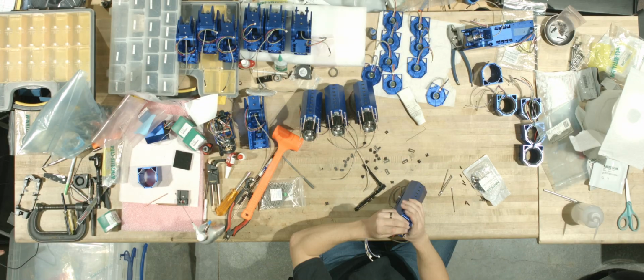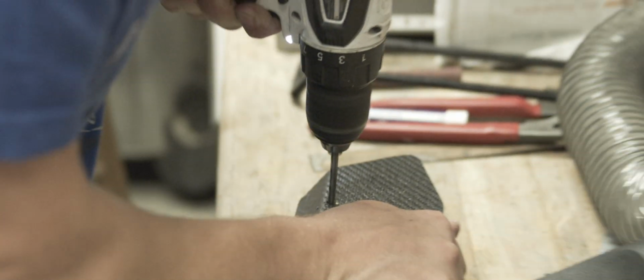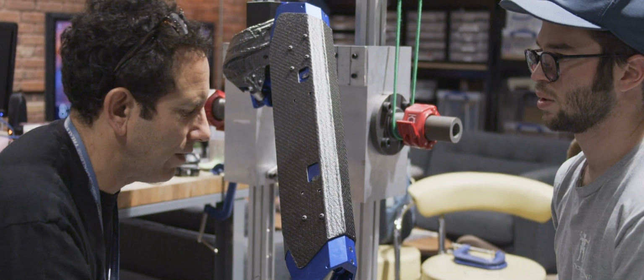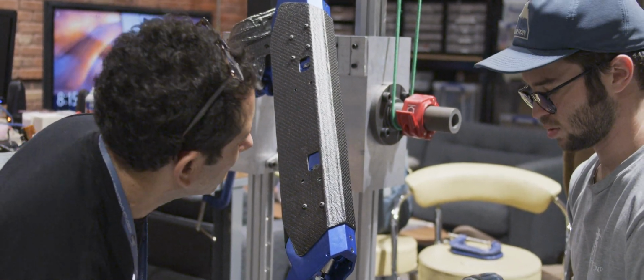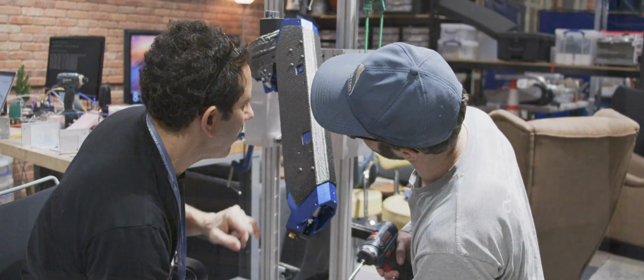We've had a few major hurdles when we received all of our components and began to assemble them. Just a few slight tolerances that weren't quite met, where we had to file down a few edges so that we could assemble the carbon parts onto the machined components. We had a few slight issues with tolerancing on the encoder gaps.